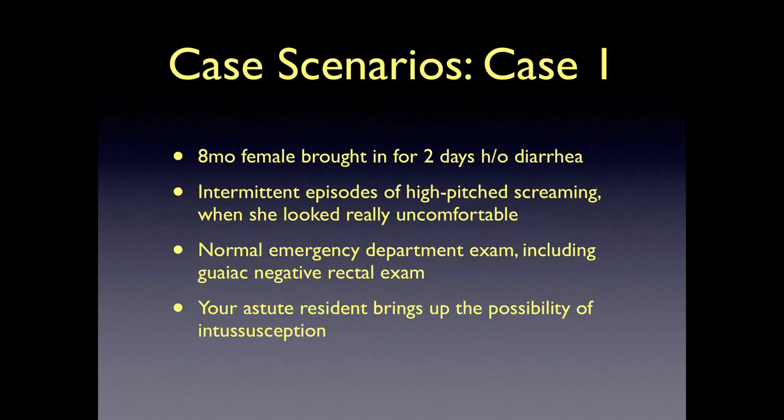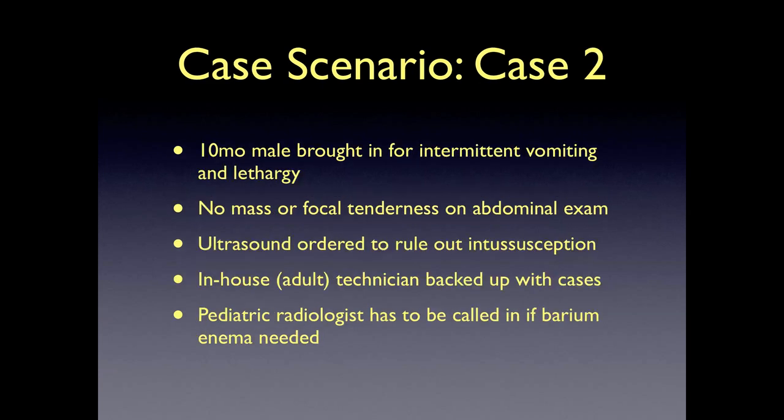Going back to our case scenarios, in the first case, we had a low clinical suspicion for intussusception, and a negative bedside ultrasound will allow us to comfortably rule out the condition and discharge the patient home. In the second case, we have moderate clinical suspicion for intussusception. A positive bedside ultrasound will allow us to expedite the workup with a timely call in to the pediatric radiologist for definitive care. A negative bedside ultrasound should prompt us to look for alternative diagnoses for this patient.